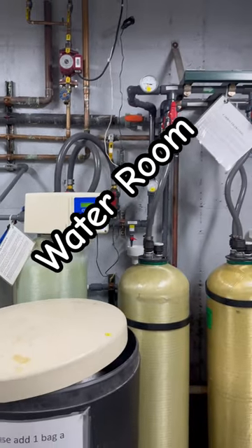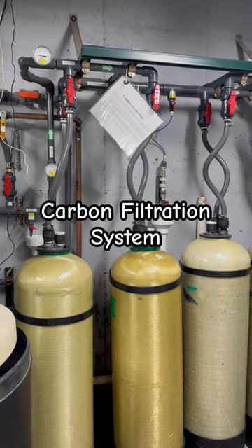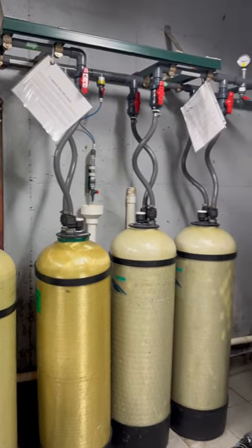This is our water room. First we have the water softener, and then the water goes through the carbon filtration system. This is going to clean the water from all the chlorine and chloramines, and this is where we do our four-hour water check, checking for the chlorine and chloramines.